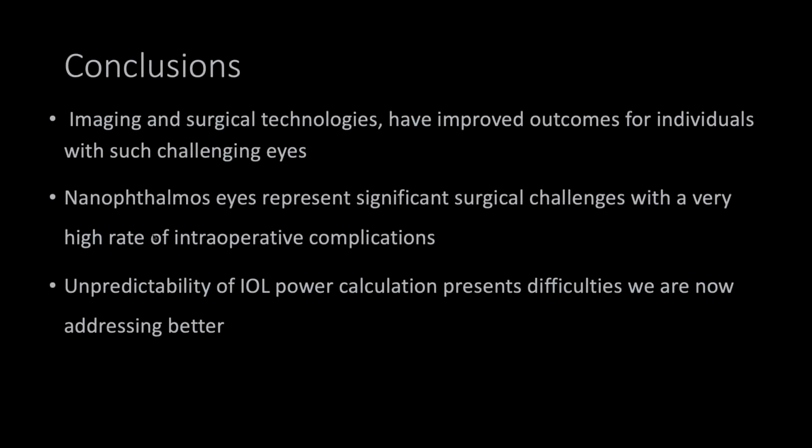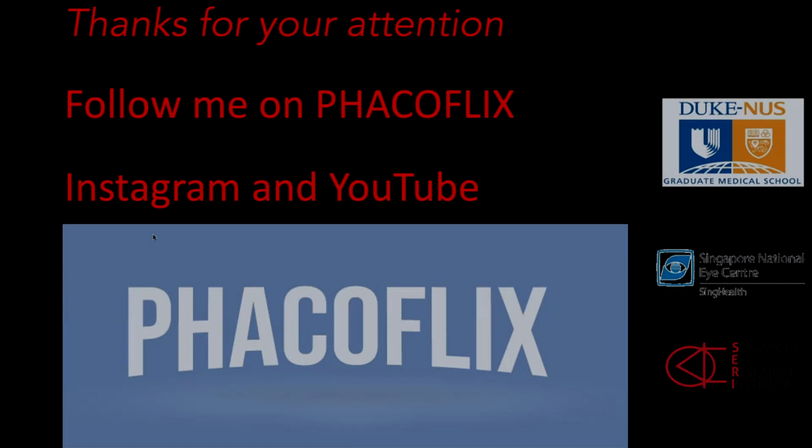So basically, in conclusion, it's very important to use our tools of imaging and surgical technologies to improve our success rates. And we've actually done very well more recently with the success rates in these individually challenging eyes. So nanophthalmic eyes do represent a significant surgical challenge with a very high rate of intraoperative complications. And of course, our biggest problem to date is the unpredictability of IOL power calculations. And actually with these, we do much better now with the newer formulas, and we're getting our eyes to see better. Thank you very much.